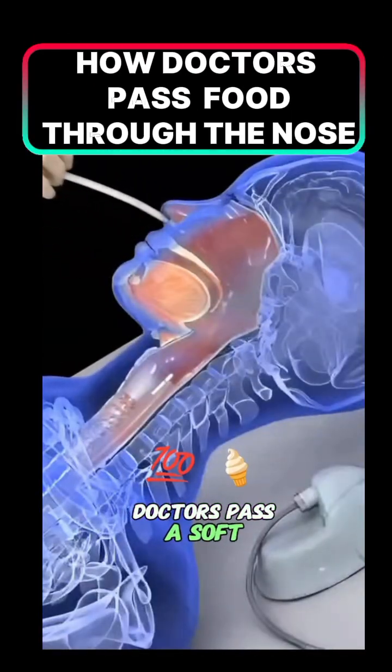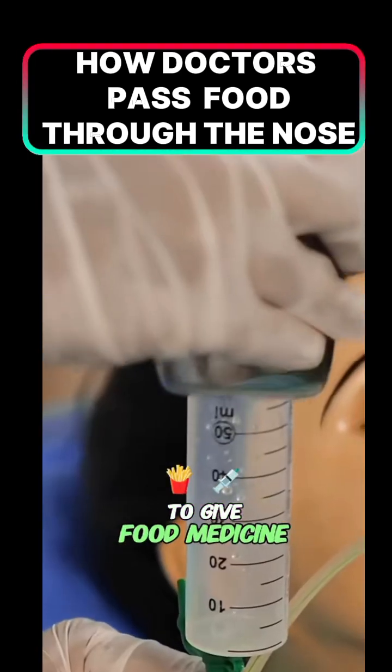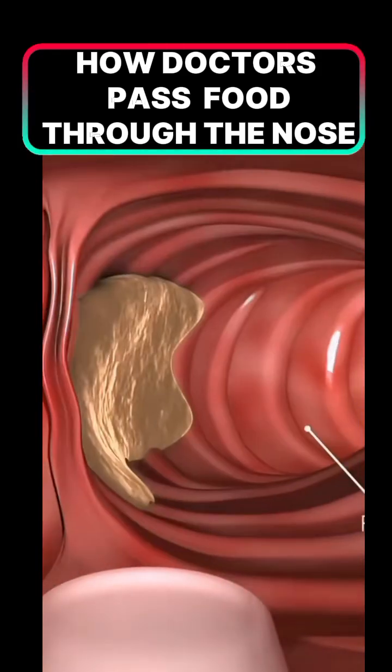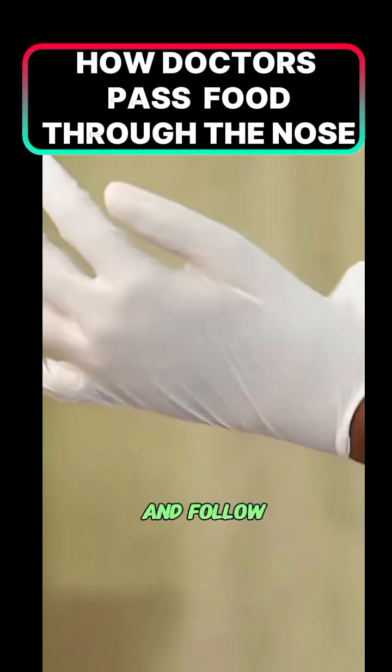Do you know how doctors pass a soft tube from your nose directly into your stomach to give food, medicine, or remove stomach contents? Watch till the end to see how an NG tube is inserted.